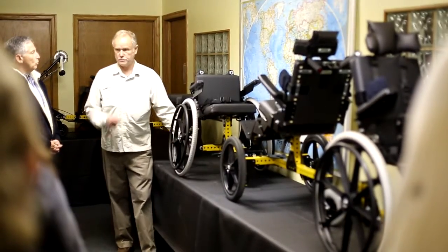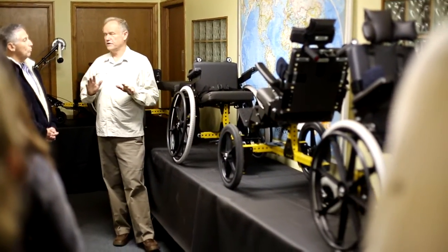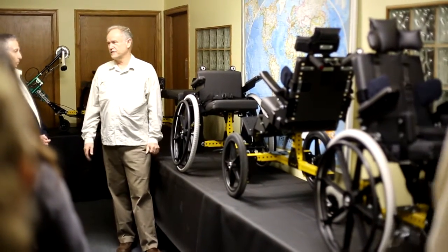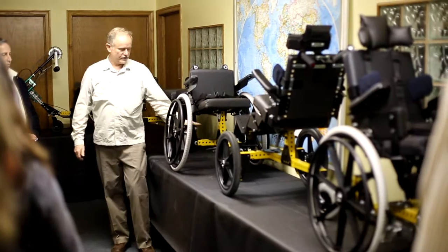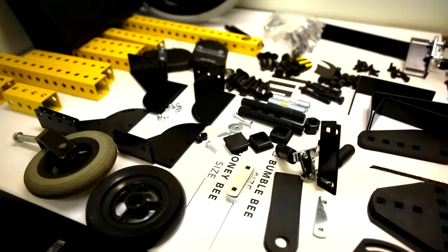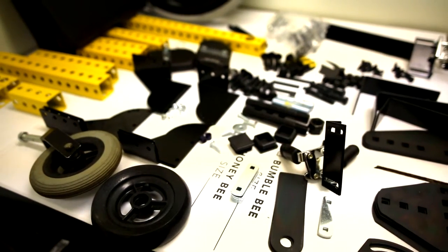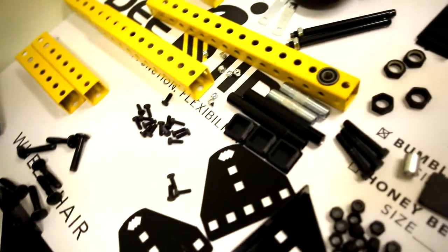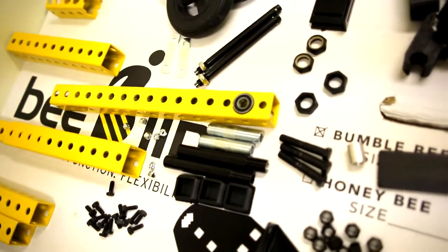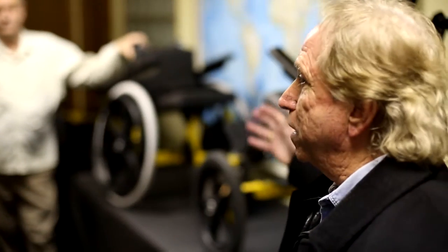We're in the process of getting another bracket here which will allow us to put a small caster on back for an anti-tip, because if you've ever seen athletes spinning around playing basketball, they need that extra wheel. These are not commercially sold, so it's not like you're trying to pick from a catalog. Each design is made with the heart of giving something that's ultimately usable for each person that's getting it.